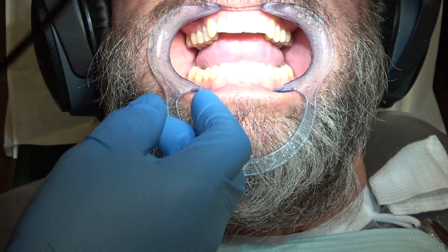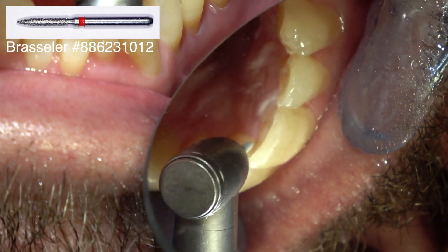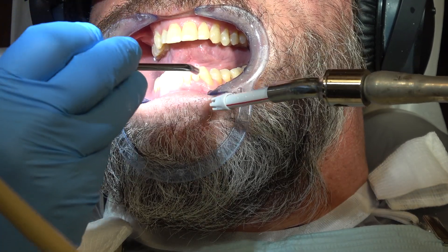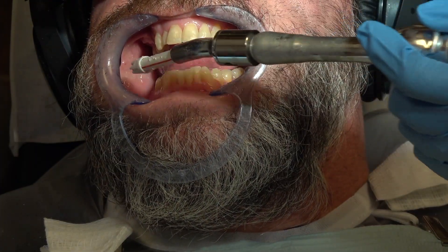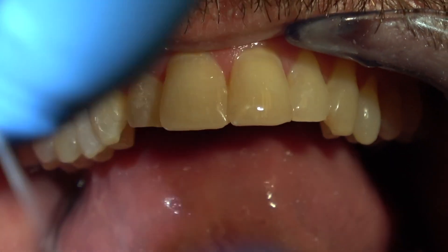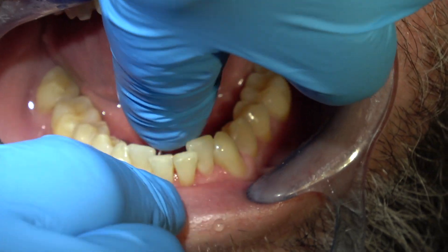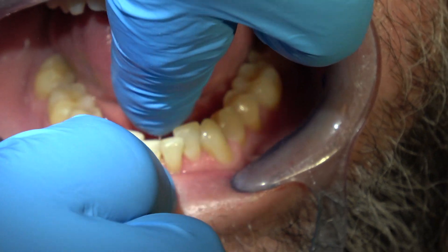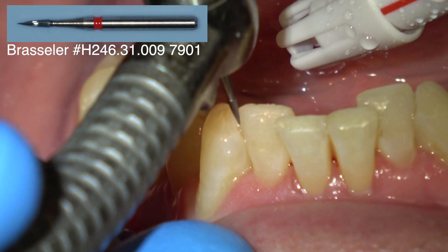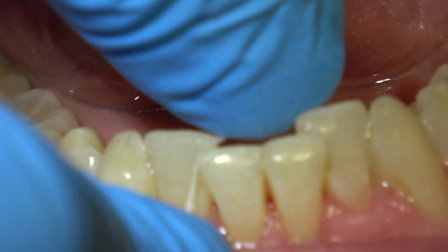I'm going to stand up and look at this from the front — it just evens things up. The teeth are not all the same length, but you don't have that broken look. Dry it off so you can see where the composite ends and the tooth begins. Let's check the interproximal — this is unwaxed floss. You have a little tightness in a contact, so this is just a 12-fluted carbide bur to remove a little composite from that contact.